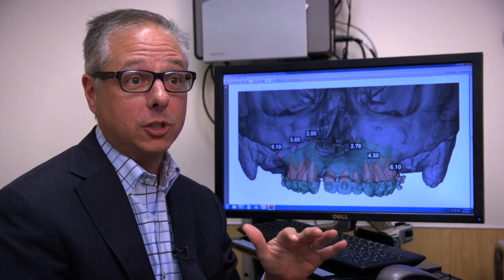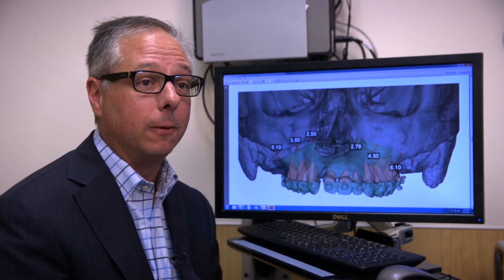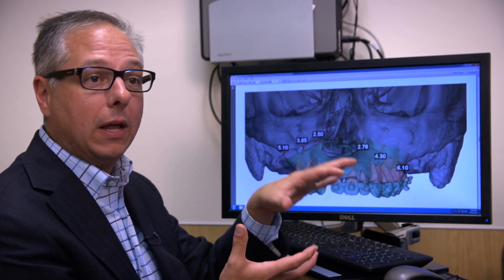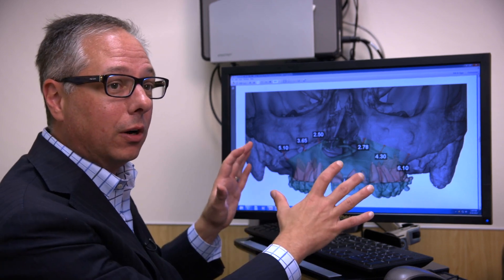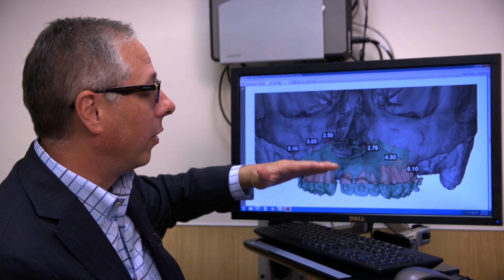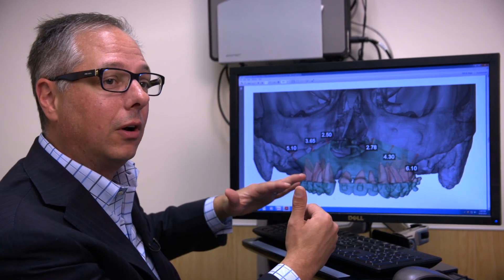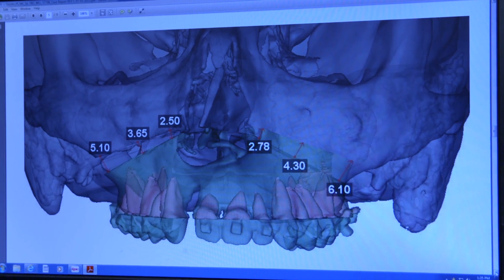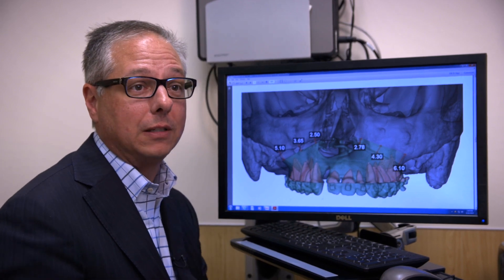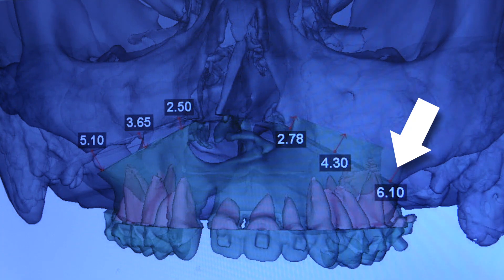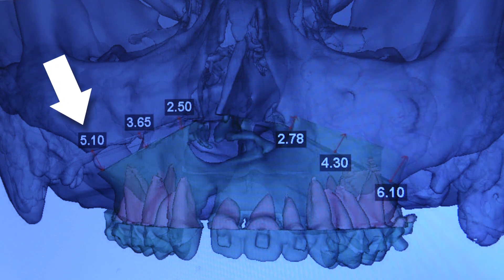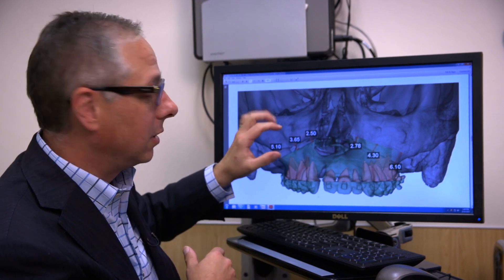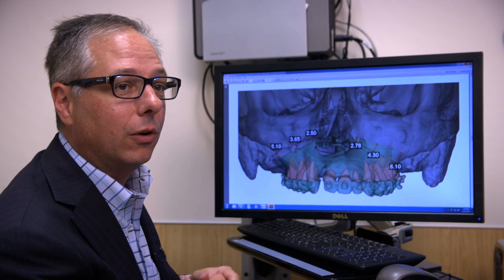One of the best examples of the precision that virtual surgical planning can bring is demonstrated here in the maxilla, or upper jaw, motion. After the models are wed to the three-dimensional CT scan on the computer, we look at how we're going to move the maxilla — up on the right and down on the left. By adjusting the resolution of the CT scan, we can see down to the millimeter where the tooth roots are located, making sure those are preserved and safe throughout the entire procedure. For this patient, the maxilla is coming up six millimeters on the right side and coming down five, giving us a perfectly horizontal occlusion.